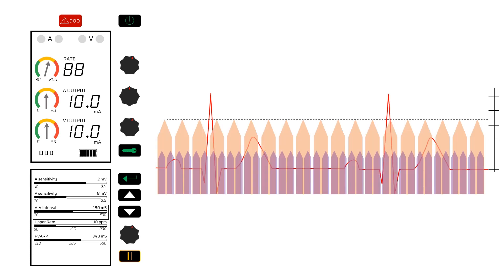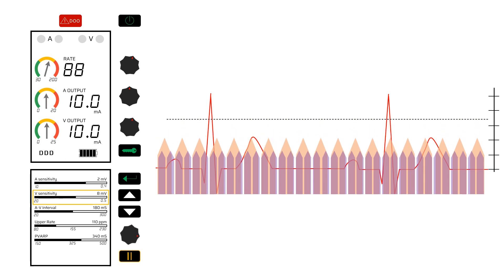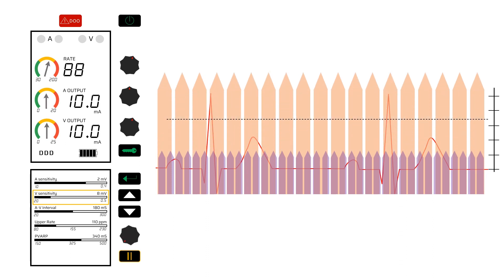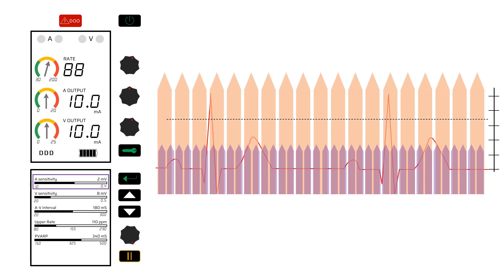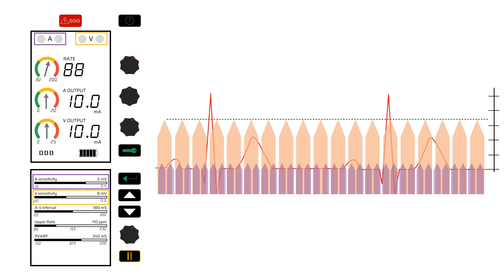In DDD, we set the sensitivity for the atrial and ventricular leads independently, as the voltage changes in these chambers are very different. We select which sensitivity to change using the up and down arrows on the pulse generator. Ideally, we want the atrial sensitivity set to detect P waves, and we want the ventricular sensitivity set to detect QRS complexes but not T waves. We can see if it's sensing appropriately by looking at the lights on the pulse generator and comparing this with the ECG.